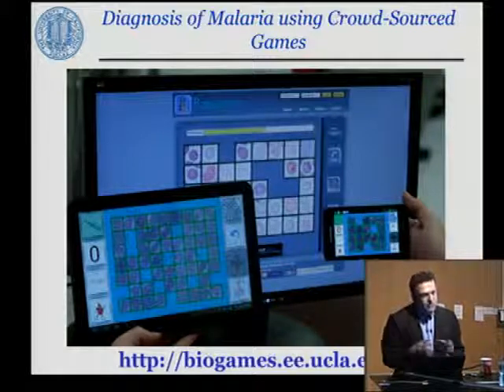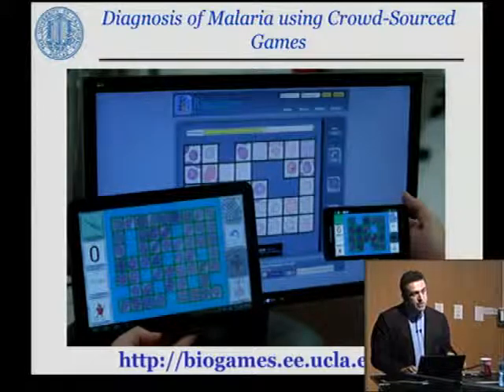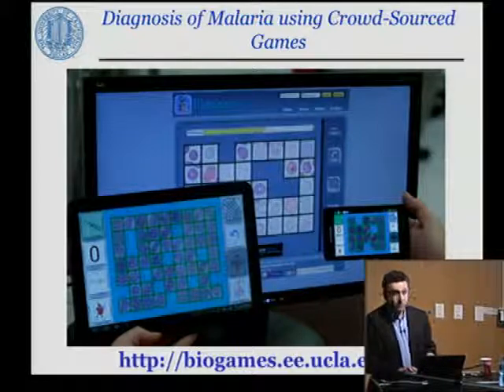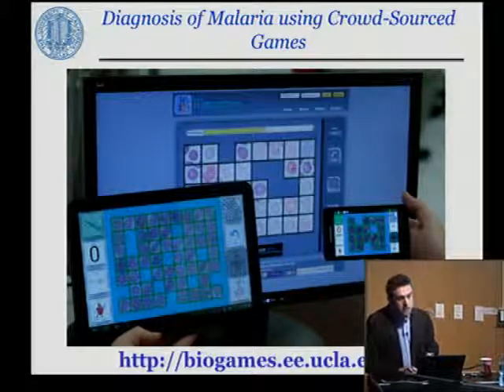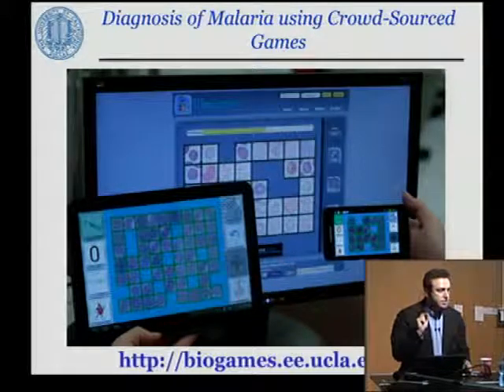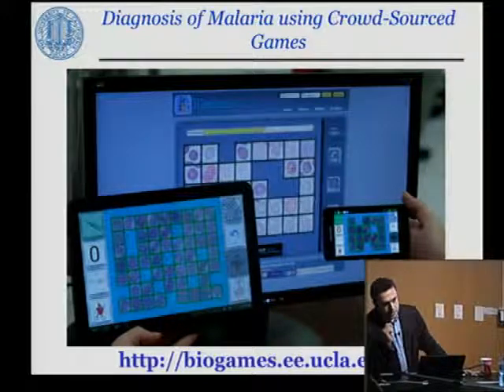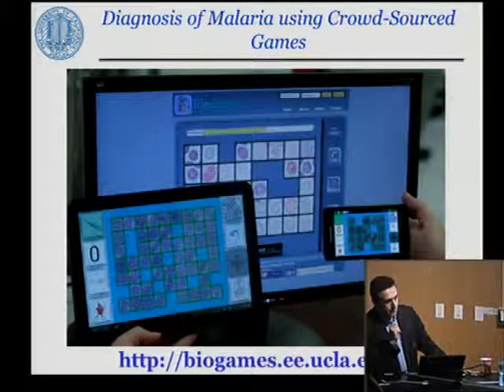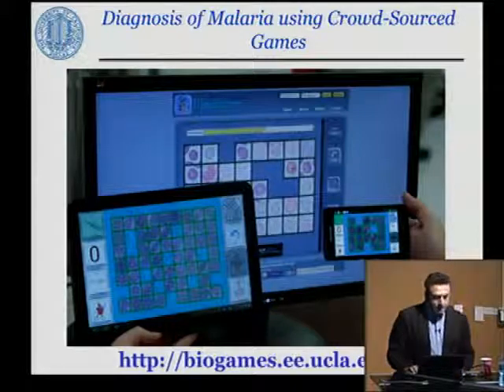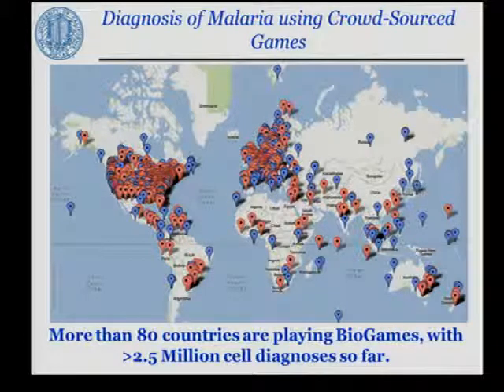There's something smart here, which is that on every screen, we have images that we're trying to find the correct label for. But there are also images that we know the labels for, which means every time you're clicking on a single page, we also evaluate your diagnostic accuracy. We assign you false positive and true positive rates based on the known image that we hide within a screen. And there is a nice mathematical interface that converges from your clicks to the correct diagnosis.